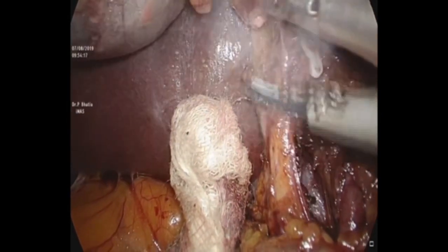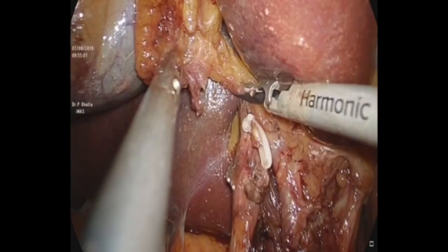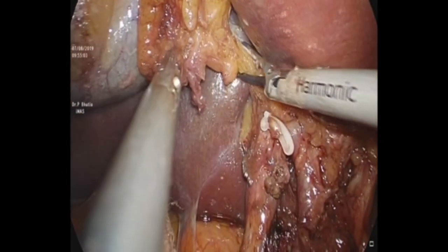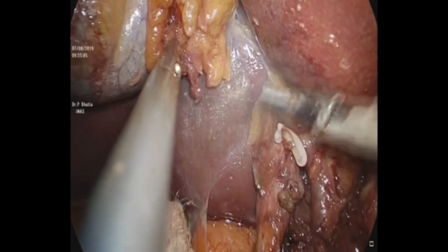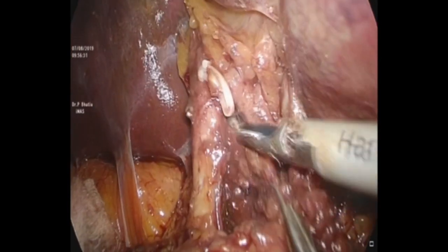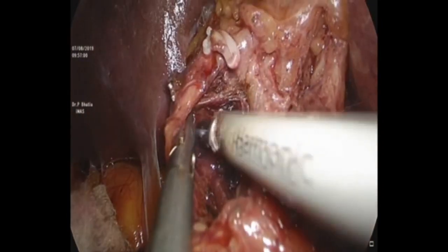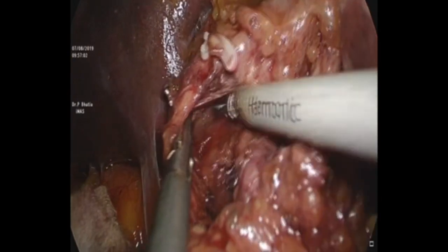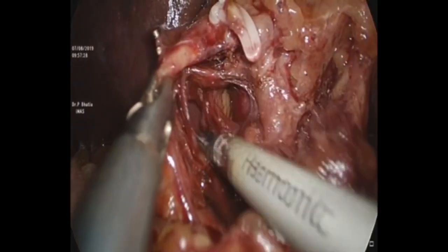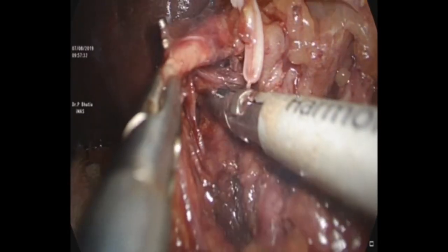Since the frozen section was negative, we did not proceed further with extrahepatic common bile duct resection and hepaticojejunostomy. We could take the hepatocystic triangle fibro-fatty tissue and we must emphasize that we are working retroportal vein at this point.